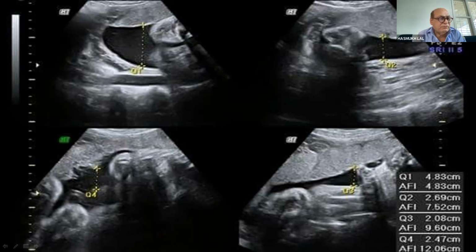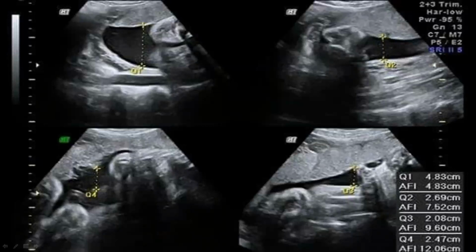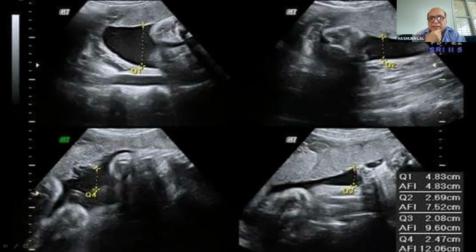Number 8, what are the fetal biometries done in 2nd and 3rd trimester ultrasound? I think Ajit sir already elaborated on 4 points. We have to do BPD, then head circumference, then abdominal circumference, and then femoral length. When we do it on-site, Ashok sir does all the 4 in one sliding movement, from BPD, HC, AC, and then FL.